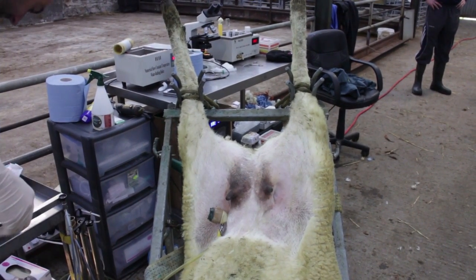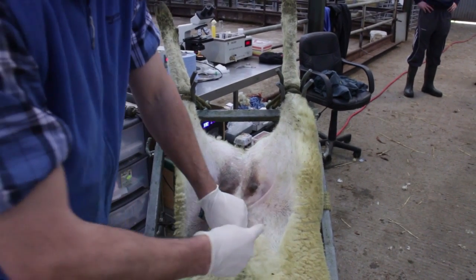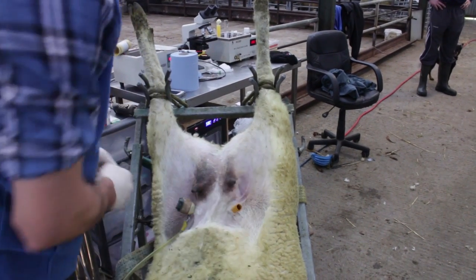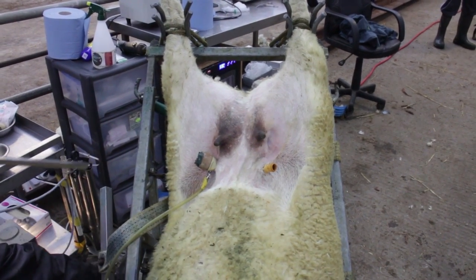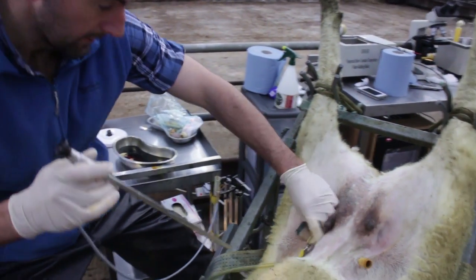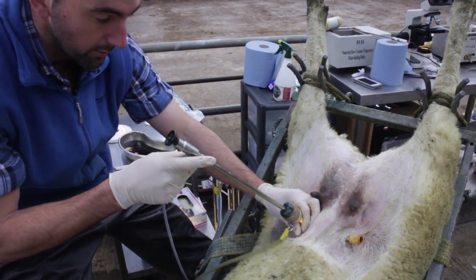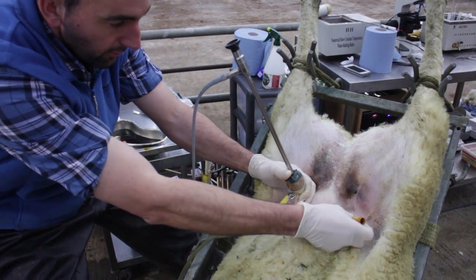We use a five millimetre trocar on the right — that's the side the AI gun will go through. Again, it's a blunt incision and there's no bleeding. The left hand side is the side the scope goes in. The scope is connected to a light source, so effectively it's a mini camera. We go in the left hand side to visualise the interior, and the right hand side is for the AI gun.